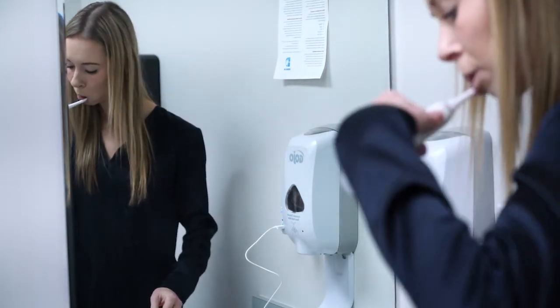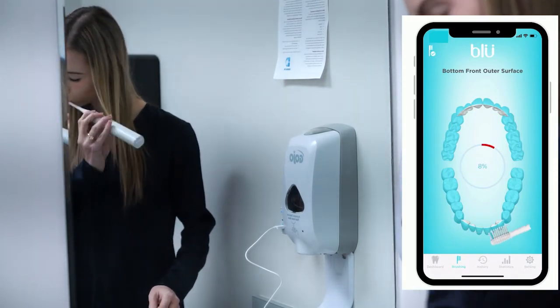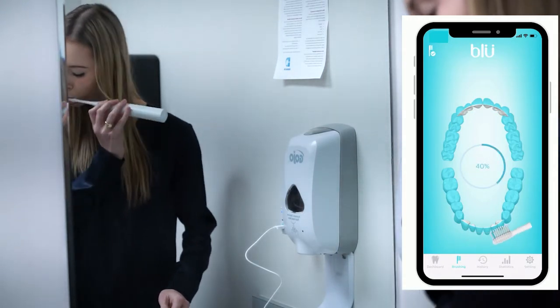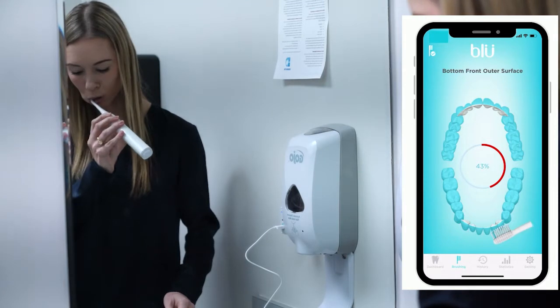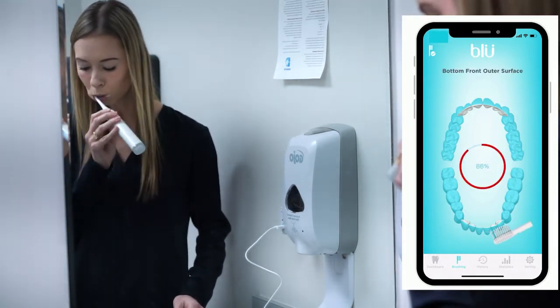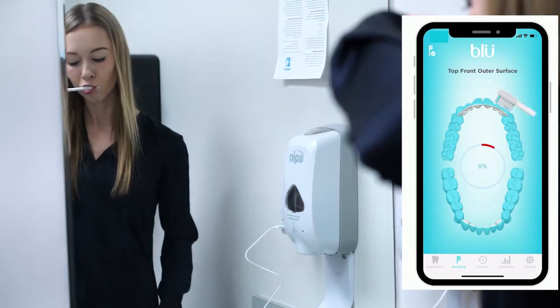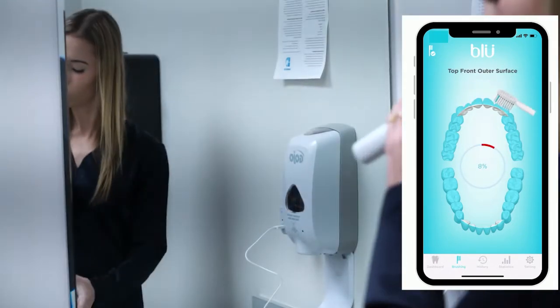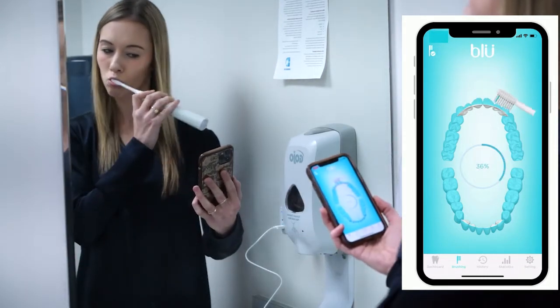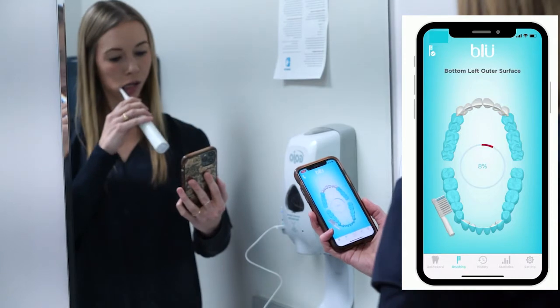For the purpose of this tutorial, I will show the screen showing you the wrong zone, as I was brushing very vigorously, and I tried to change and pick up my toothbrush, and it noted I was not brushing my teeth. So it will tell me wrong zone, which means I need to pick up my toothbrush and complete that quadrant. If you don't do it in the allotted amount of time, it will move to the next quadrant and you will begin brushing those teeth surfaces, and it will prompt you on which tooth surface you should be brushing.